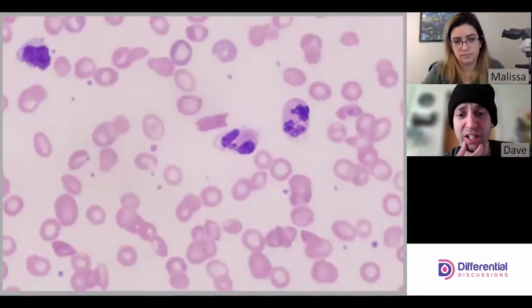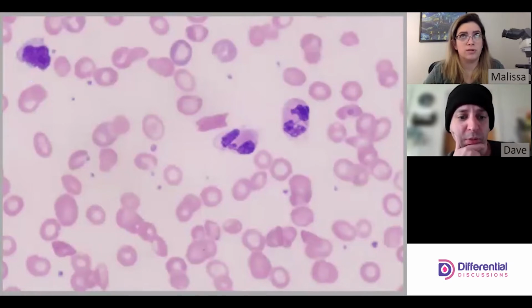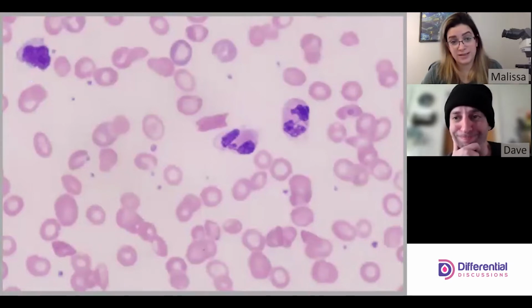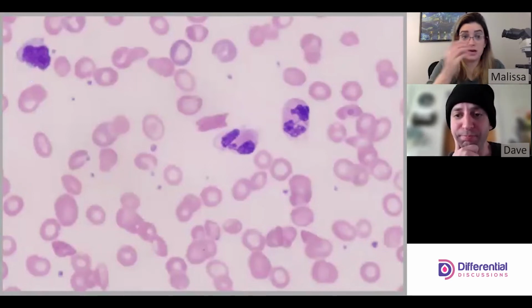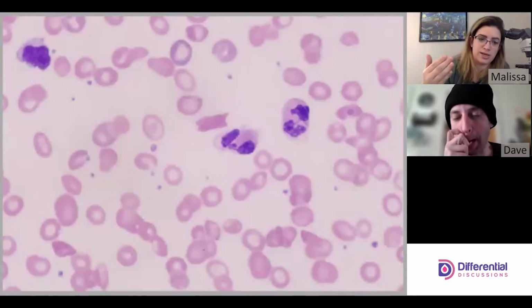And thrombocytosis, not uncommon with a sickle patient too, right? So sometimes you will see an elevated platelet, high normal platelet. So more opportunities for platelets to be on red cells. Yeah. So that's due to a couple things. Inflammation. Platelets will always increase during inflammation. And it may not increase above the reference interval, but it'll increase above the patient's baseline. So it really depends on what the patient's baseline is before the inflammation.